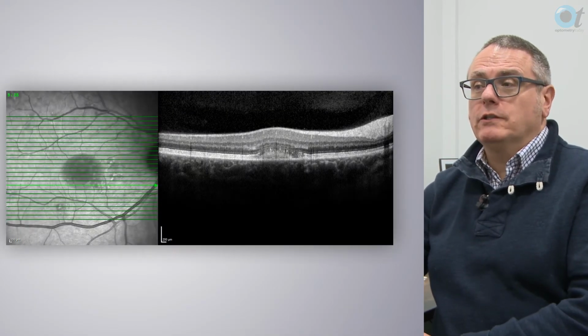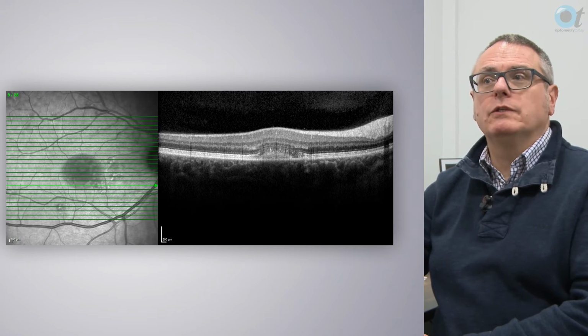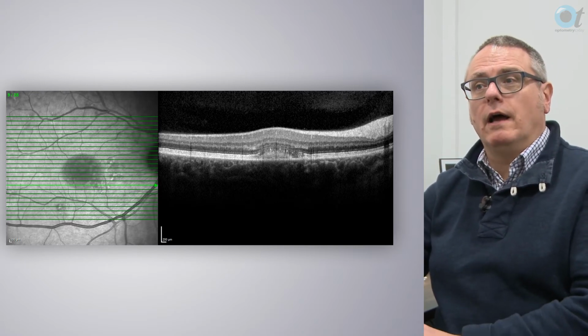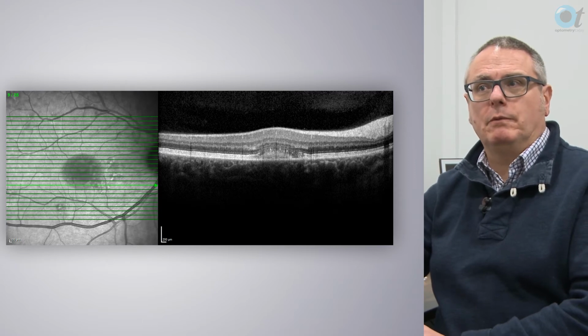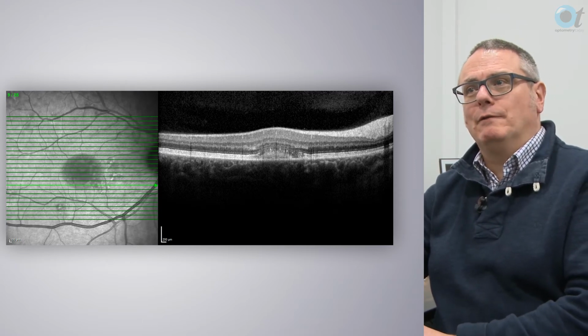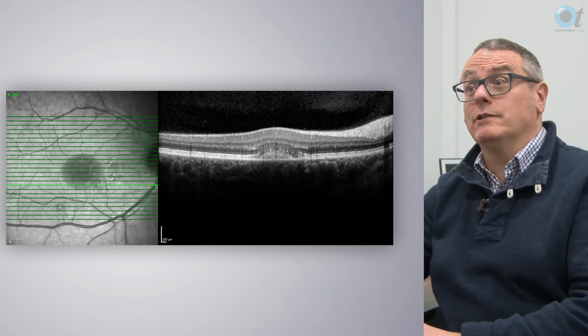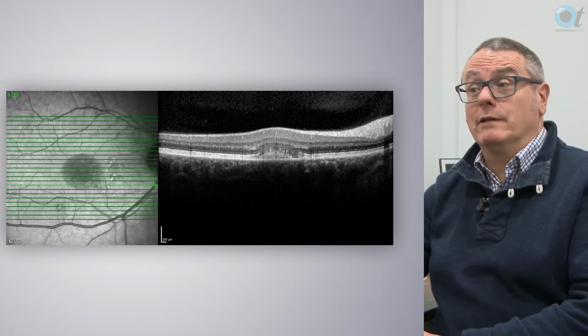The section that we'd taken out from the OCT volume scan is trying to highlight a very subtle defect in the retinal pigment epithelium. Now, unfortunately, I've had the benefit of being able to see other investigations carried out for this patient, and I know exactly that's the location where the break in the blood-retinal barrier is located.